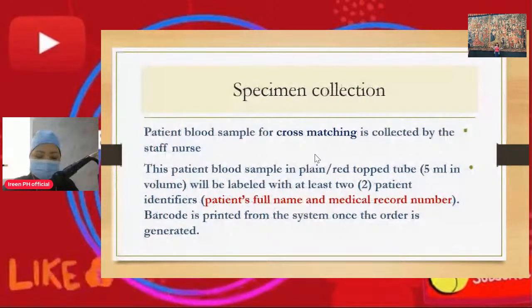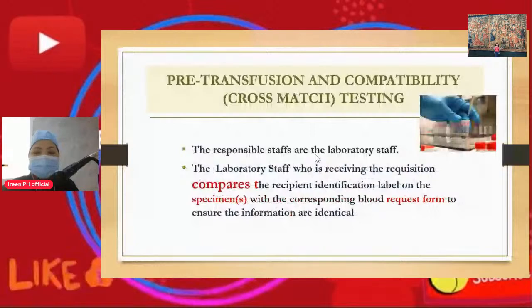Pre-transfusion and compatibility cross-match testing. The responsible staff are the laboratory staff. The laboratory staff who is receiving the requisition compares the recipient identification label on the specimen with the corresponding blood request form to ensure the information is identical.